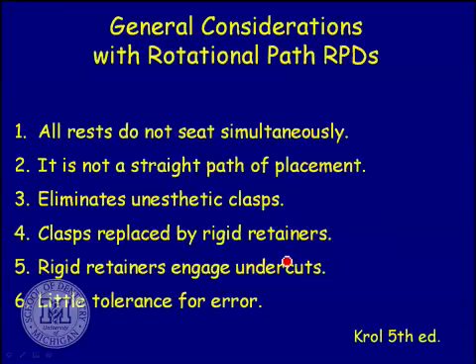So for those that have, or for the people that are about to deliver some partials, what often happens is you try the partial denture framework in to make sure it fits okay, and you take a bite registration. So you say, gee, Dr. Shotwell, the framework fits pretty good. We got the occlusion adjusted, and we took a bite. Now you come back and you go to deliver the partial with the teeth processed on.